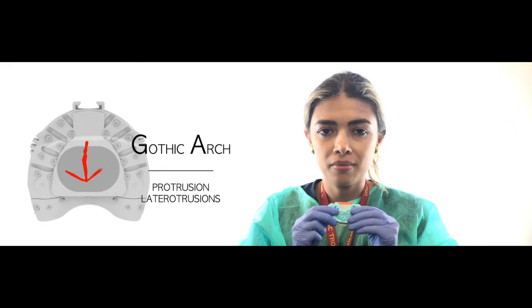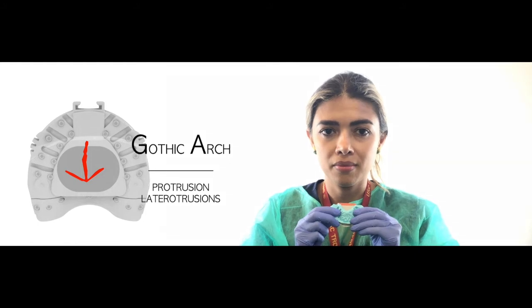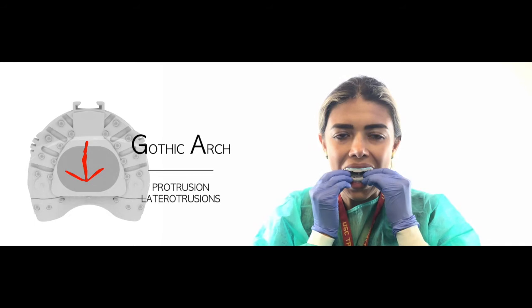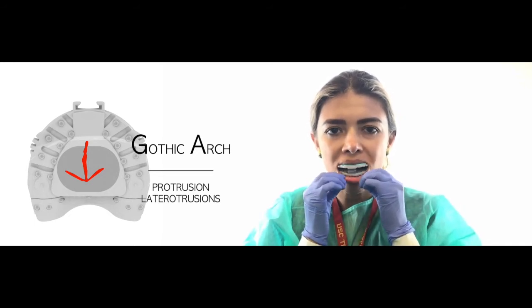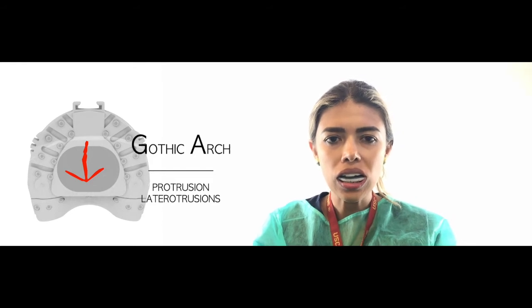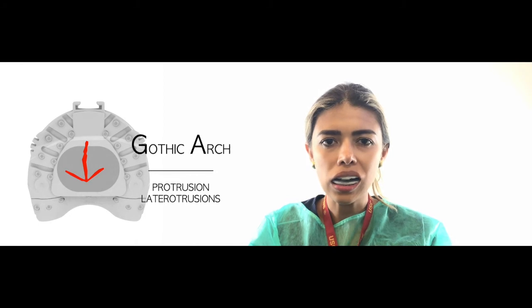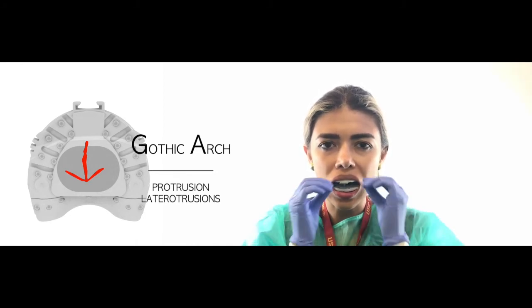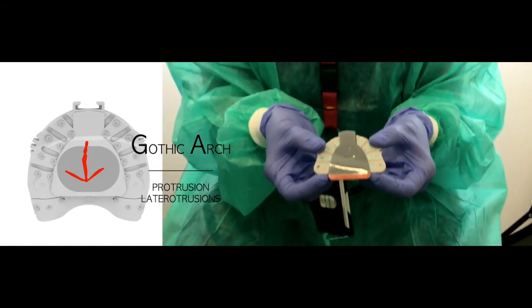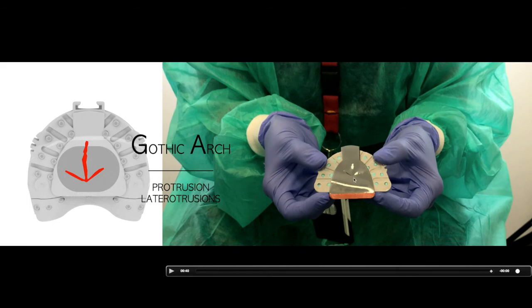Protrusion and lateral excursions complete the gothic arch tracing. First, place the maxillary plate device and mandibular device, have the patient relax and gently touch, then move protrusion forward and backward, then right side, backward, and the other side. On the maxillary plate, you can now see three lines showing — this is the gothic arch tracing, one of the graphic recording methods.